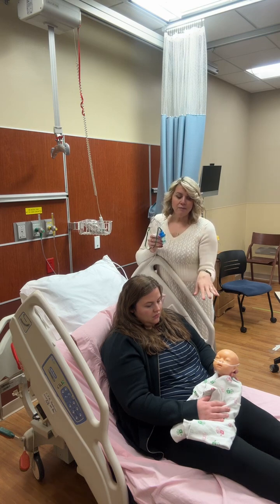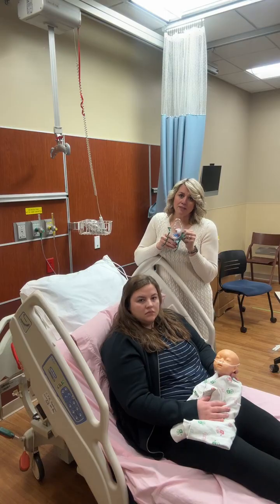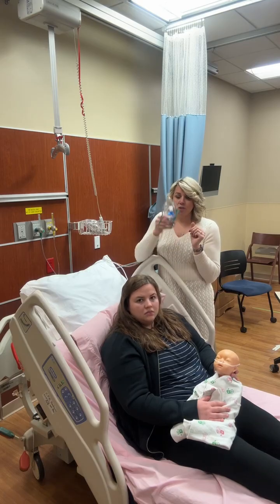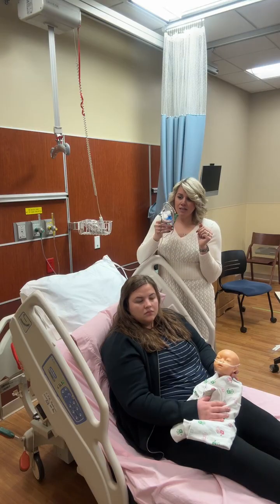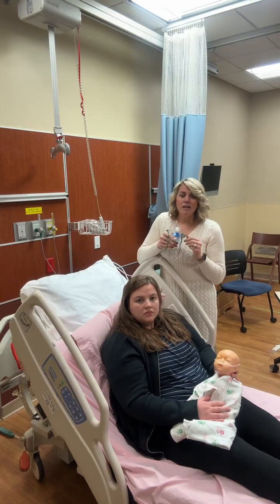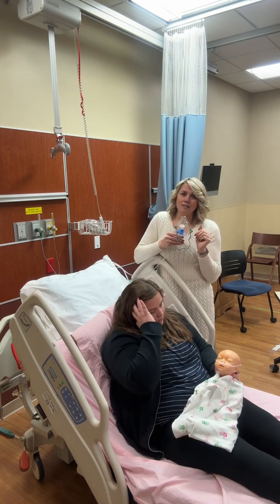Also, let's say this baby was 1, 2, or 3, and we try to use a mask because we think that the child could possibly understand the importance of using this mask. But if the child is going to protest you because this looks scary, and anybody in the medical field that comes at a child with any piece of equipment is going to look like it's going to hurt them, they're going to be scared of you. They're going to thrash. They're going to try to tear it off. And you're going to have an interrupted nebulizer that's not going to be therapeutic at all, and they're not going to get the medication. So there are other ways to ease the child into this.